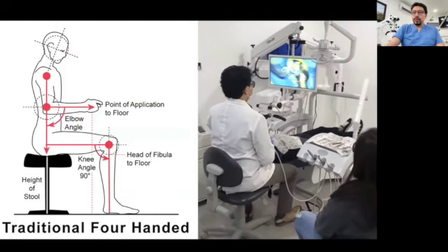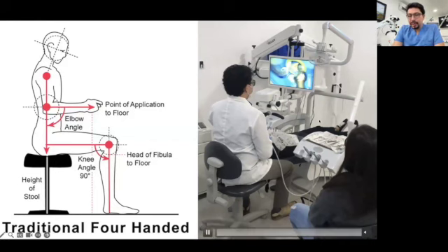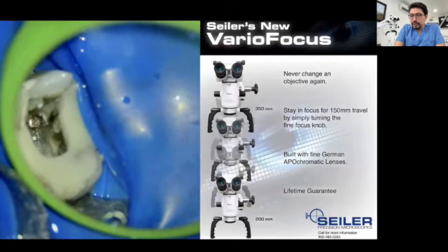So it's advisable to have this type of chairs as well. But even without those type of chairs, you can see that my position by that time when I was just starting with the 3D microscope was a good position.